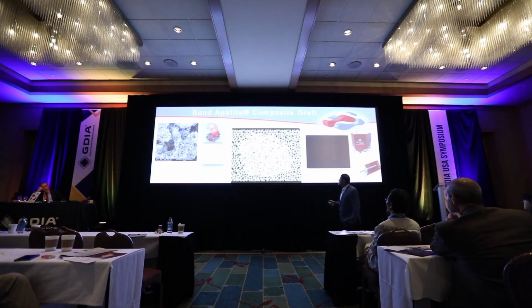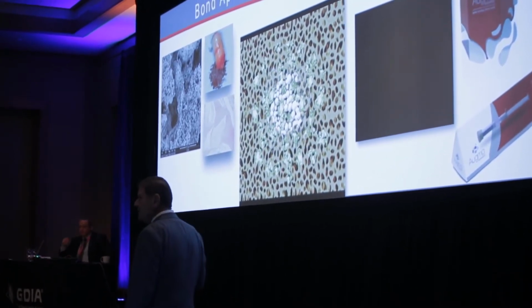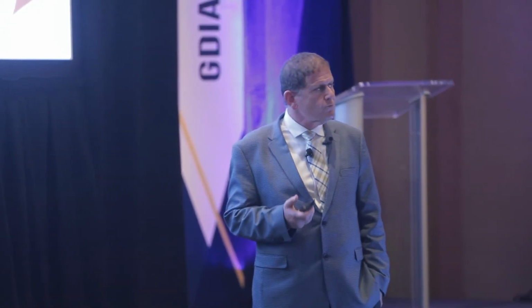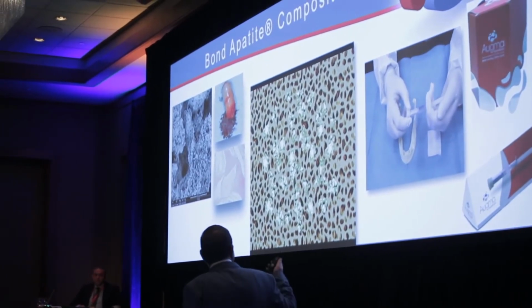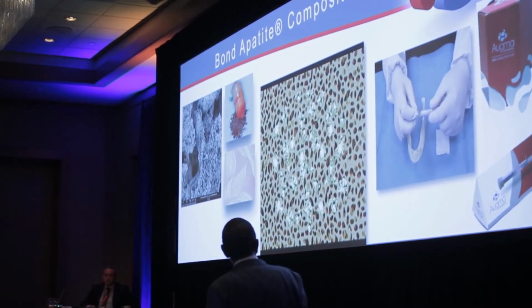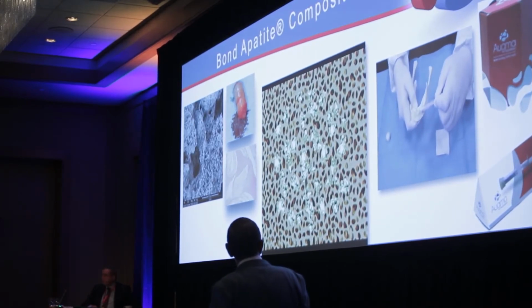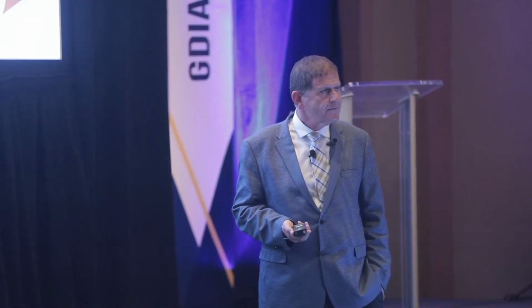Now, when we use a composite graft, when one matrix is resorbed relatively faster, and the other just helps to preserve the three-dimensional space, we're going to have much more vital bone than if we use just one of those grafts. And the technique is very simple, as you can see here. The only thing is to activate the material, eject it into the site, press for 3 seconds, and close the flap.